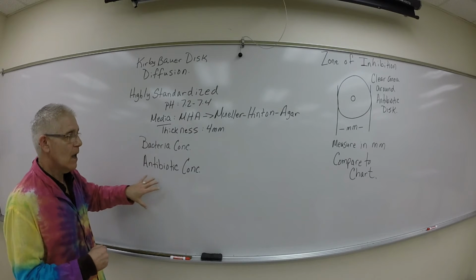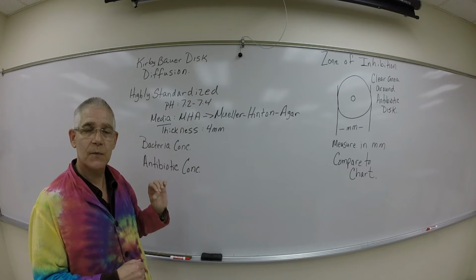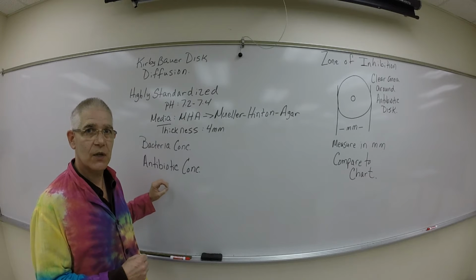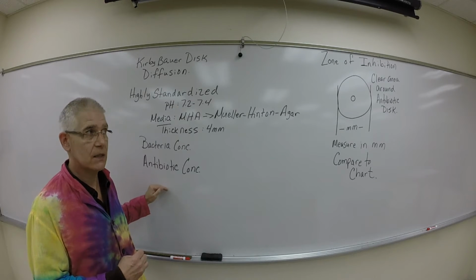And lastly, the antibiotics. Each antibiotic does have a specific concentration to it, and we have to make sure that we use the appropriate concentration for this test.